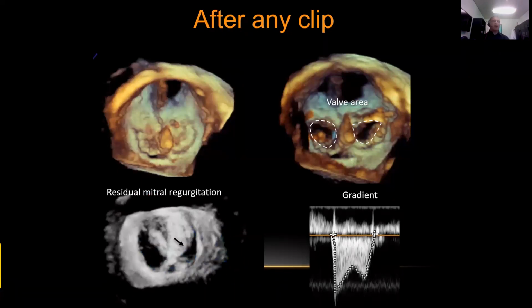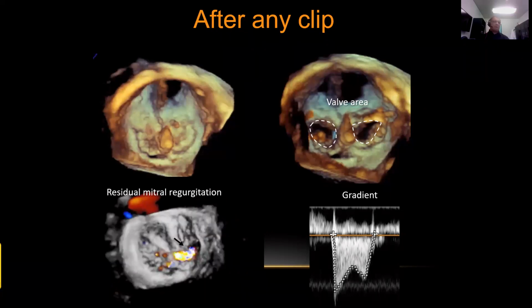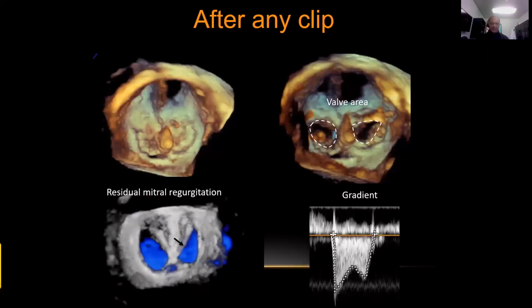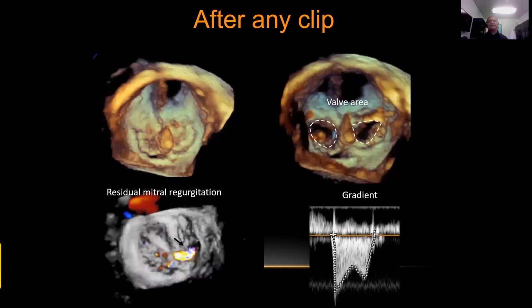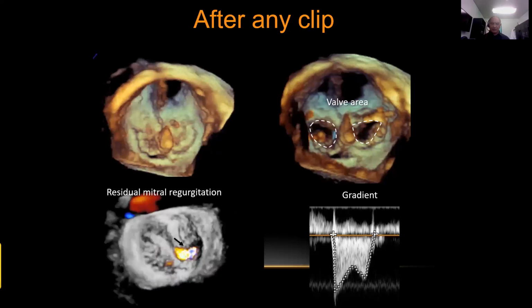For example, if you have 85-year-old patients, who do not move very much, with a mitral regurgitation that is mild or mild to moderate, it really is not warranted to risk another clip. Because you see, it's a very easy procedure, until you have a complication. When you have a complication, it is no longer an easy procedure.